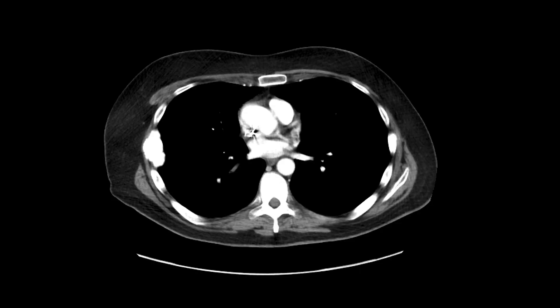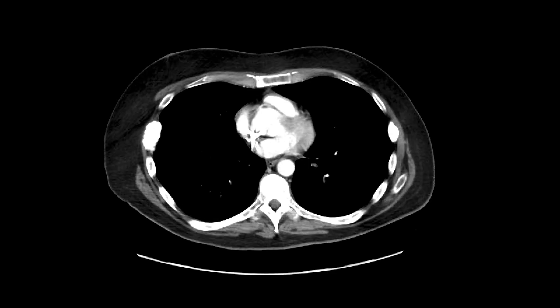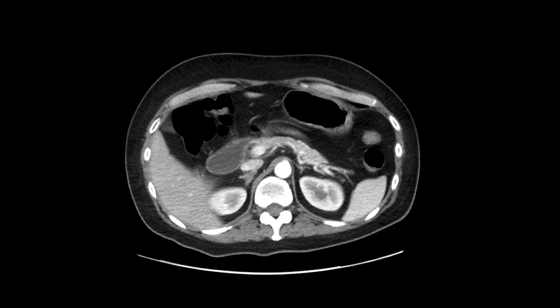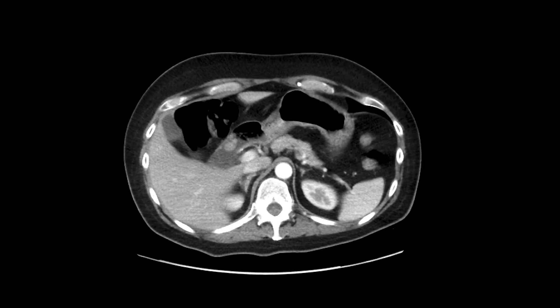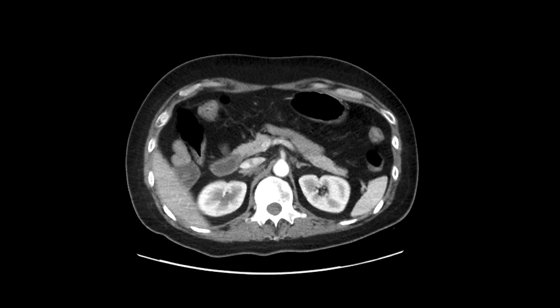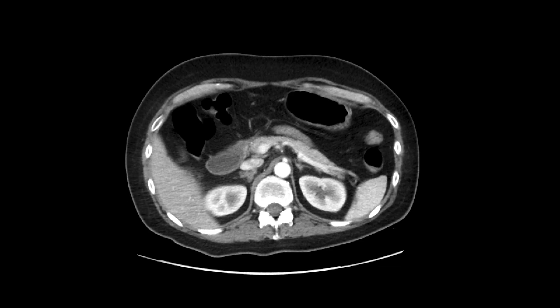This is a patient with a history of lung cancer who gets a CAT scan for restaging purposes. As we scroll down, we can notice that there's a mass in the distal stomach and first portion of the duodenum, and it's sort of a nonspecific mass. It's a very unusual site for metastasis for a lung cancer primary.